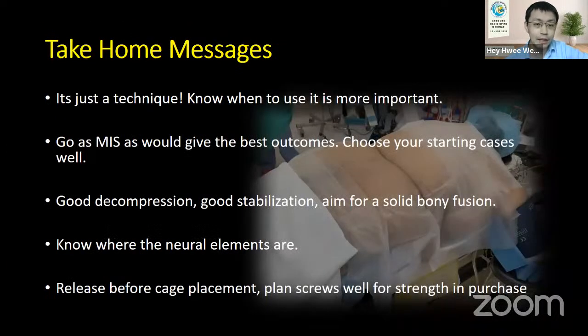All in all, the take-home message is that MIS TLIF is just a technique. You can use different techniques for a certain condition based on your capabilities as well as your resources, whether it allows or not, or training. Knowing when to use it is important. Go as MIS as would give the best outcome. If your best outcome is an open surgery, so be it. Choose your starting case as well, and if you do it slowly, usually you'll be able to pick it up.